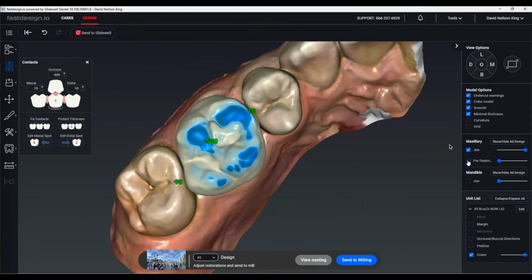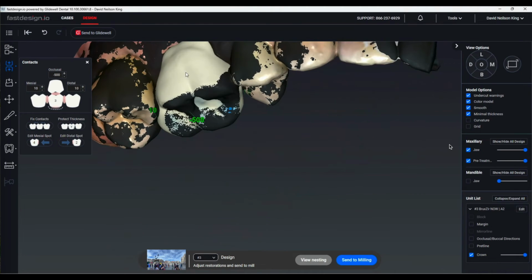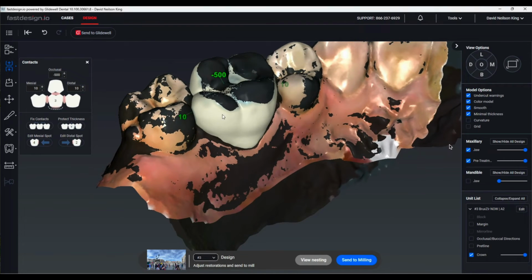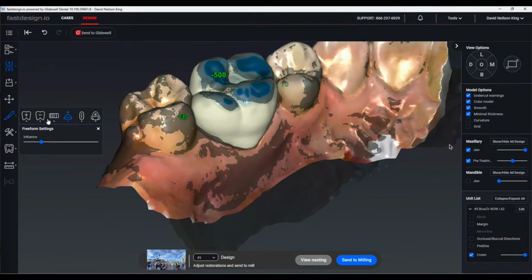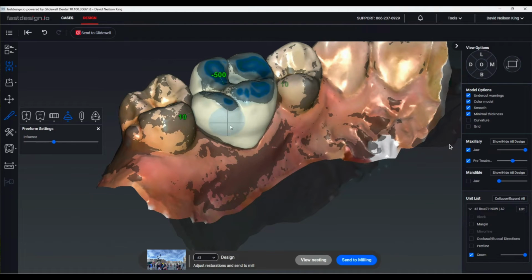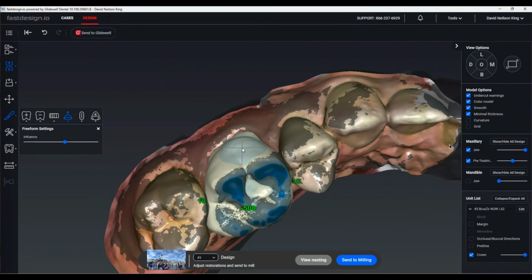But I'm going to turn on the pre-treatment scan and look. So this is obviously much wider here, and so is this. That's a little bit shallower there as opposed to how deep it was. So I'm actually going to remove some of that. So let's use one of our tools here. If I can go back there and get it to stay. So this tool basically is like your waxing tool. You're going to draw in and out if you'd like. You can add to and remove, and you can see the software calculating and adjusting. So I'm just clicking and dragging in these areas. And then I'll go back with a smooth tool and smooth.